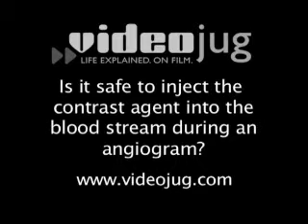Is it safe to inject the contrast agent into the bloodstream during an angiogram? The injection of contrast material into the blood vessels during an angiogram is relatively safe. However, some patients can have problems because of allergies to the medication or if they have kidney disease.